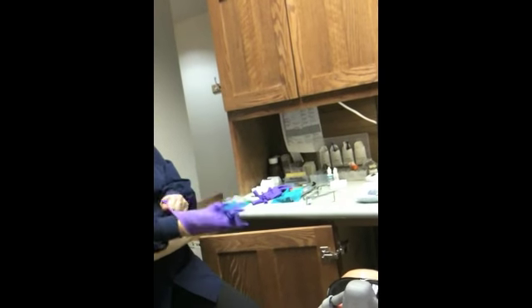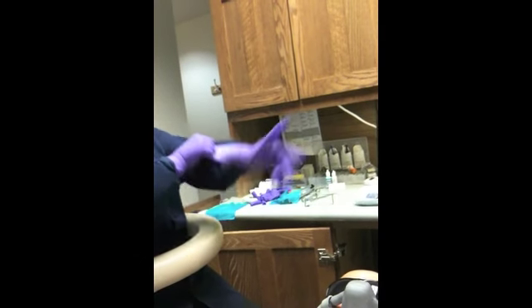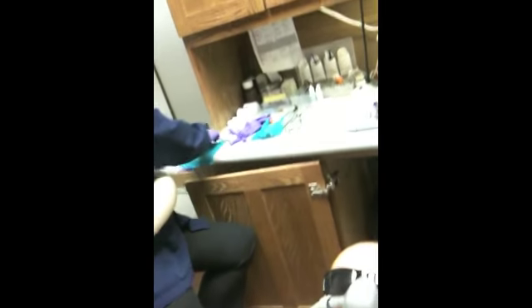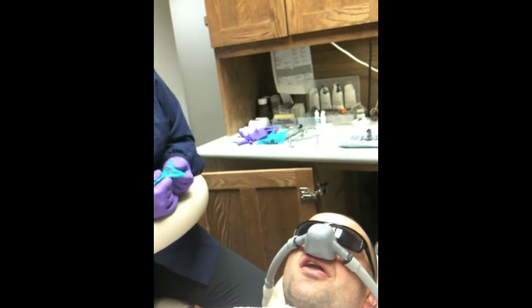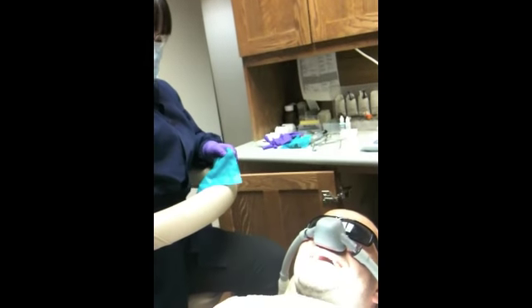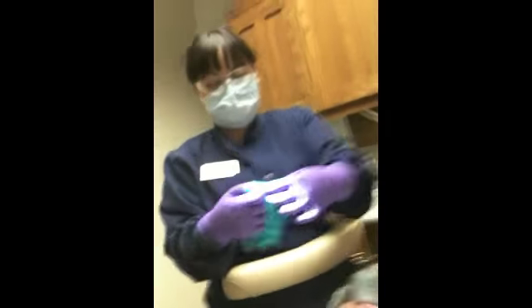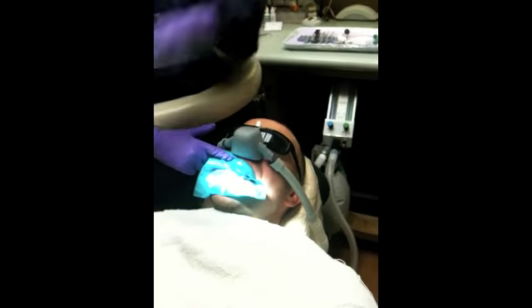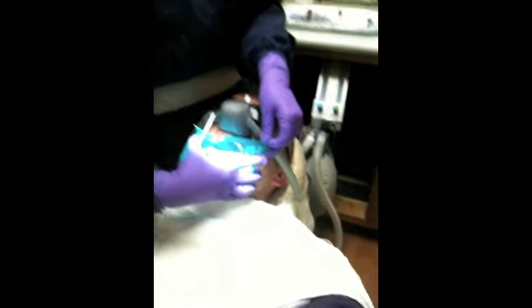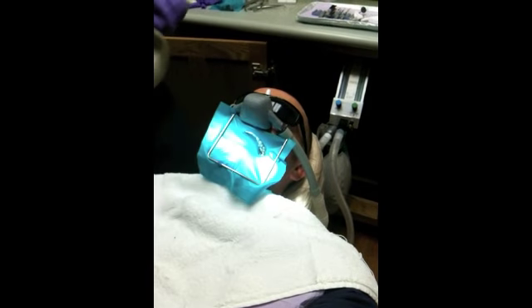We're getting it on video, so in case anybody on YouTube wants to know how to place a rubber dam in a patient's mouth. If you want to do it at home, you can go to eHow.com. Okay, watch — ready? All right, here it goes. Open, bring the frame, stretch the rubber dam out — there we go. Wow, it's done!